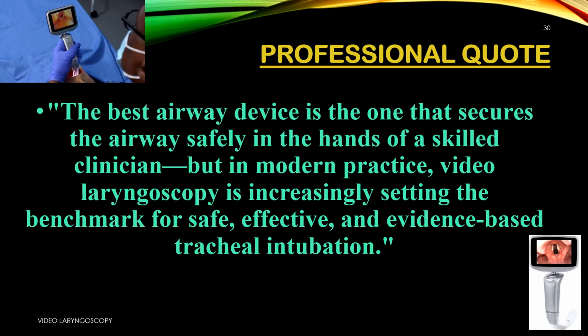Professional quote. The best airway device is the one that secures the airway safely in the hands of a skilled clinician. However, in modern practice, video laryngoscopy is increasingly becoming the standard for safe, effective, and evidence-based tracheal intubation.